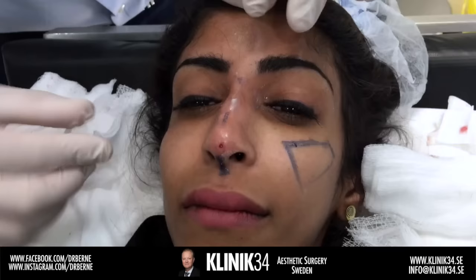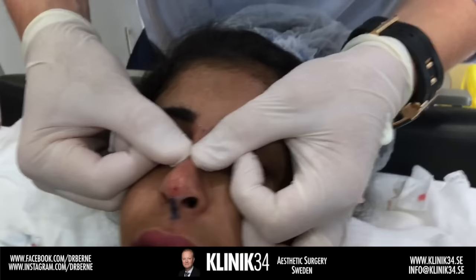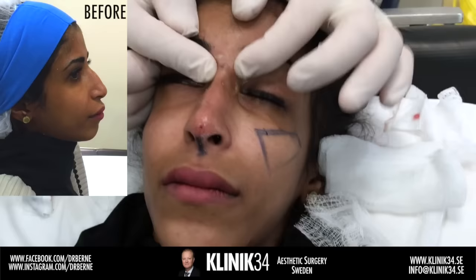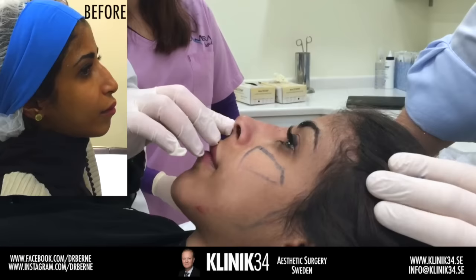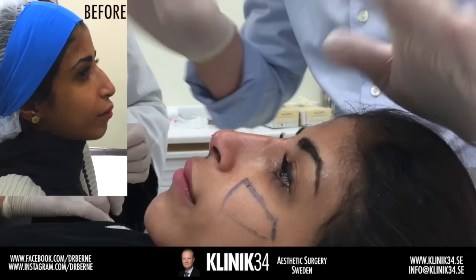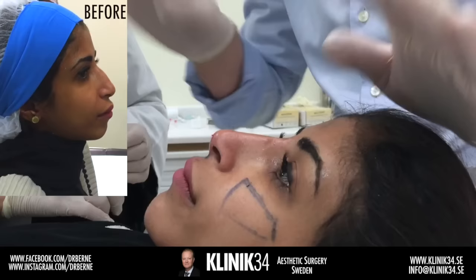There's only one way to make a nose smaller — it's to make the chin bigger. But we can also change those proportions. The combination of volume here, here, and behind has pushed that sad nose up. We added volume here — this is her own tissue responding.